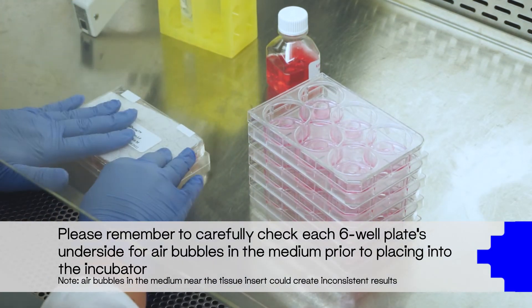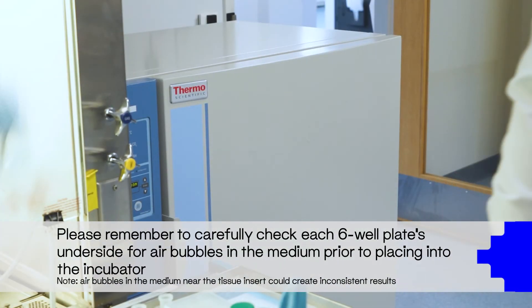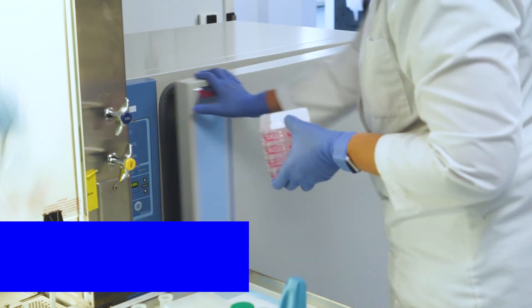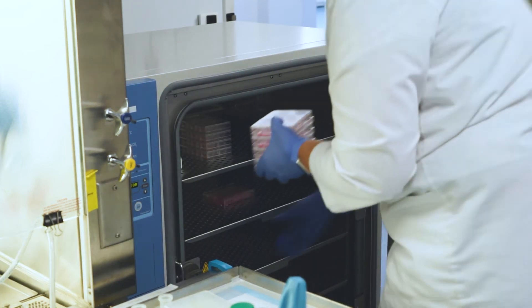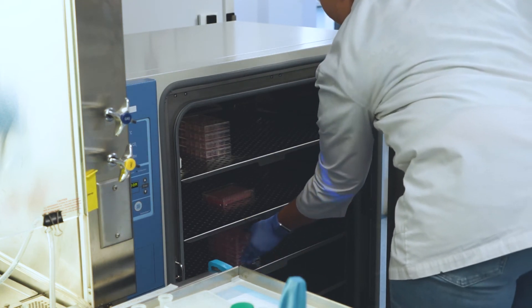Once all tissues have been transferred, place the plates in an incubator at 37 degrees Celsius, 5% CO2, and 95% relative humidity for one hour of equilibration.